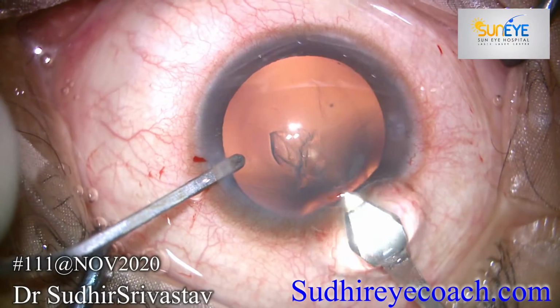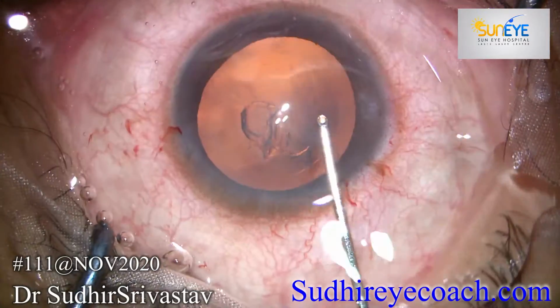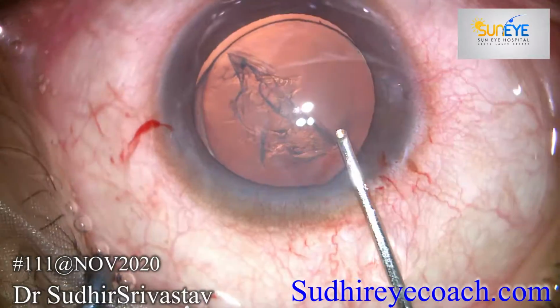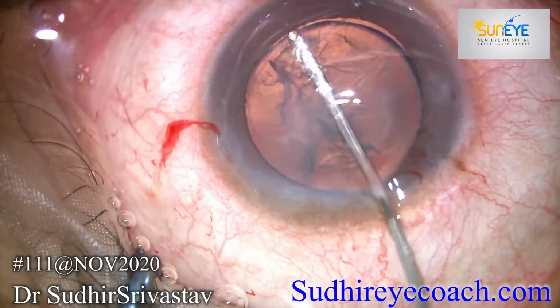One of my viewers, Dr. Varun, has asked me why do you extend your clear corneal incision? The answer is I always make an opening of 2.2 mm, but I enlarge the inner lip of the incision a little bit, and this reduces the chances of surge to almost a negligible level.